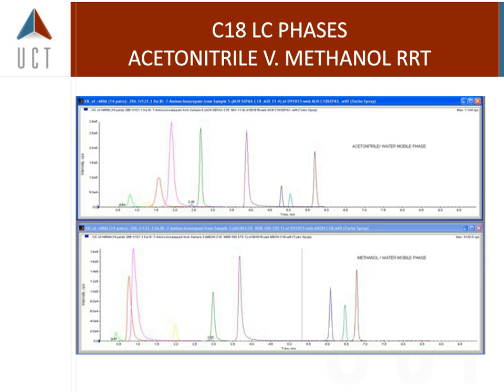So more and more groups of compounds are becoming parts of our extraction procedures, not only in forensics but also in environmental. So we're using these tools in the mass spec or the LC to try to help to understand what might be going right or what might be going wrong in those groups of compounds in our extraction.